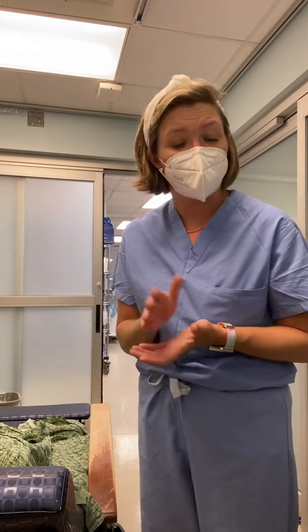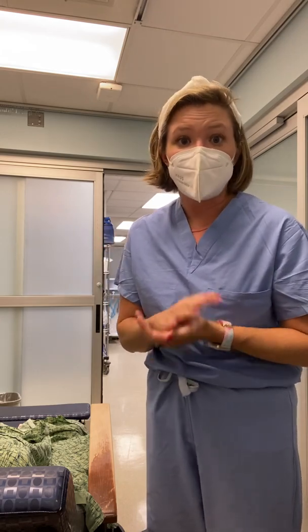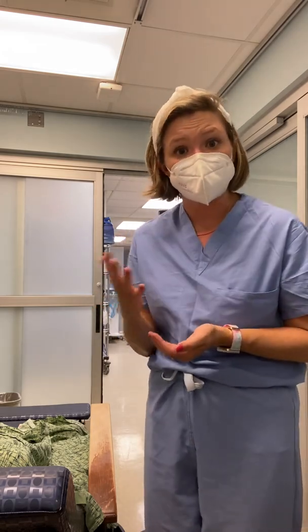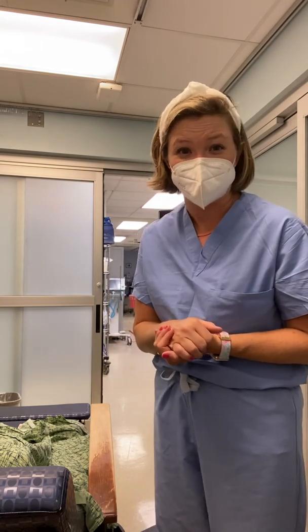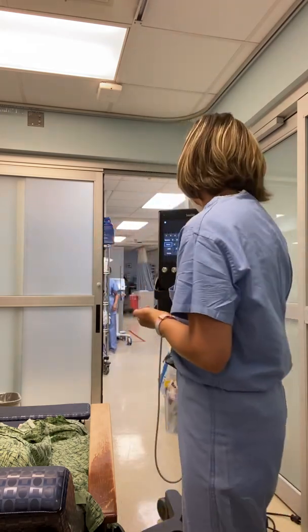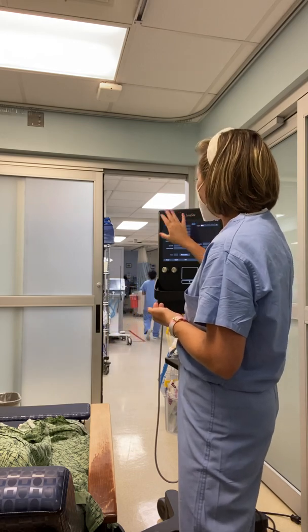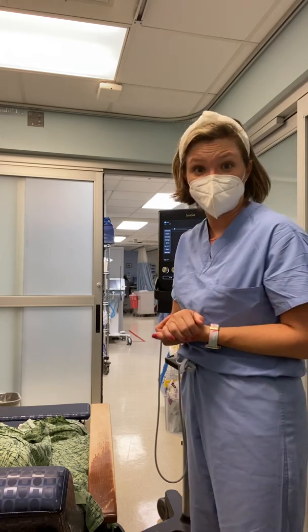And there's a nurse protocol for this, so you don't need a verbal or telephone order from the provider to do so. If at any point in time you have issues finding this order, placing it, or get a duplicate, you can simply troubleshoot that with someone else on the unit, or if you need to, call the provider performing the procedure and they should be able to assist. Once you have the patient selected in the machine, you will come back to the main screen of the ultrasound, and you will be on the screen where the patient's information will display on the top, and the ultrasound will be ready for use in the procedure.